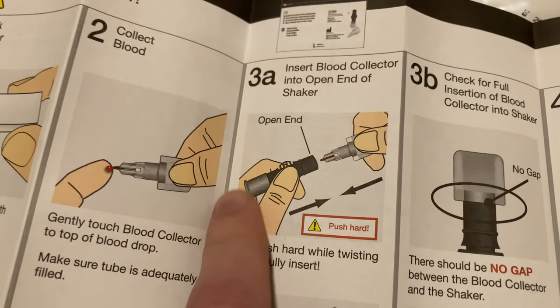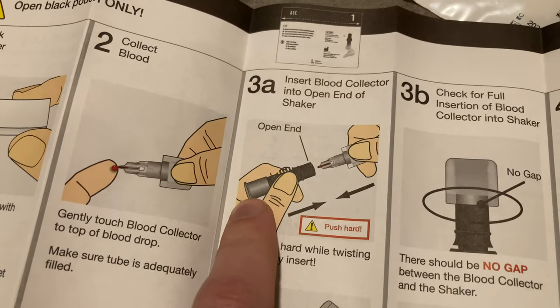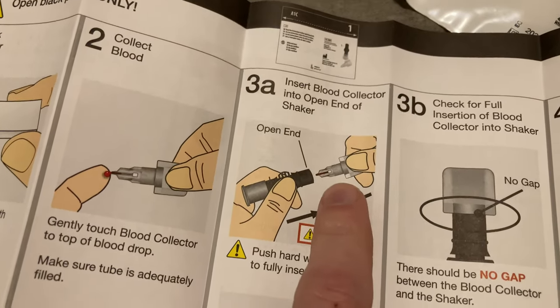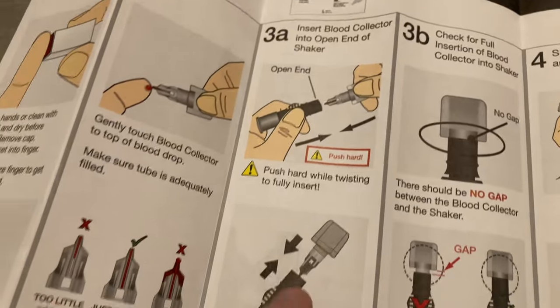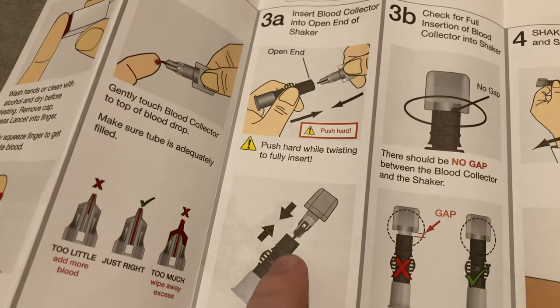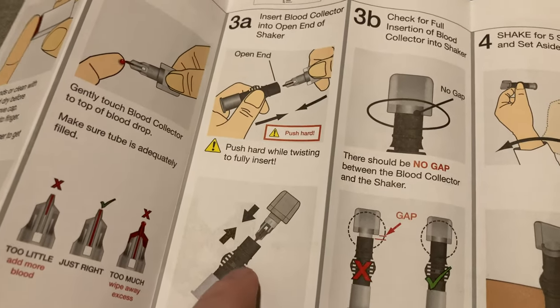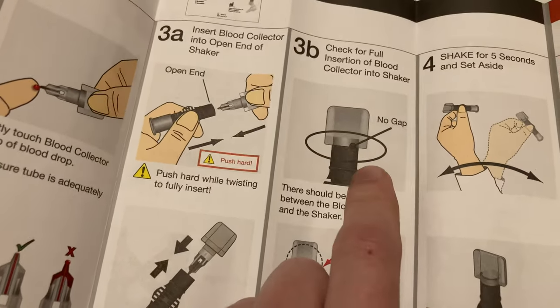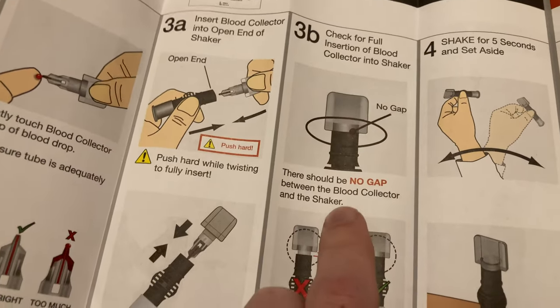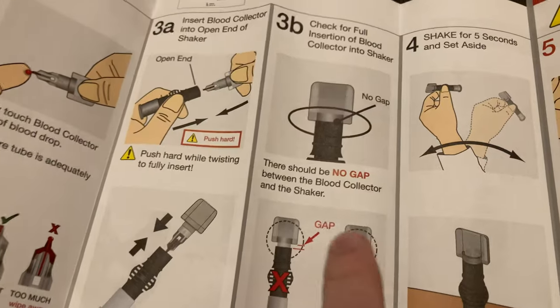So this is the base. This part, don't screw with that. Leave that alone. You're going to insert the collector that has your blood in it into the end. And you're going to push hard while twisting to fully insert that. Now, you have to make sure this is fully inserted. And that's what they say. You want to make sure that it's completely inserted. Otherwise, it won't mix with the reagent that's inside of here correctly.